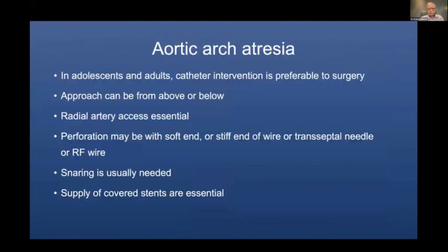The left subclavian artery is also widely patent. So to conclude, in adolescents and adults, catheter intervention is really preferable to surgery for these aortic arch atresia patients. Approach can be from above or below. Radial artery access, usually the right, but occasionally the left, is essential.